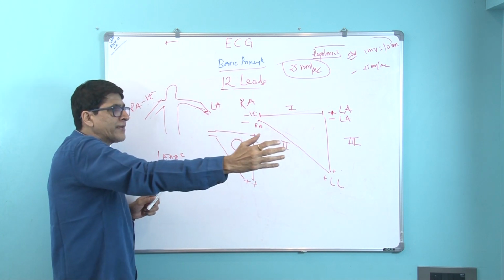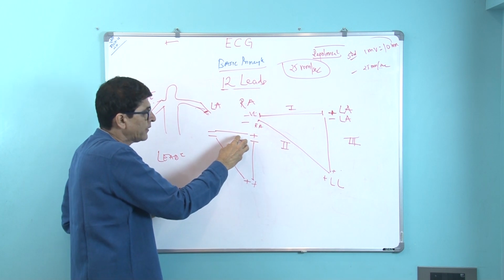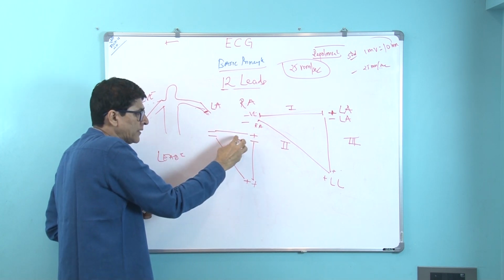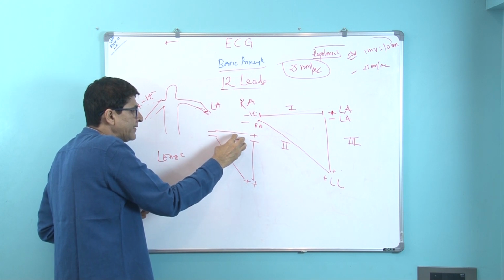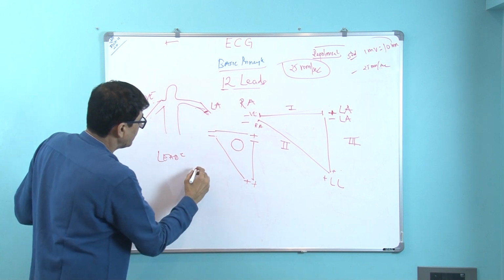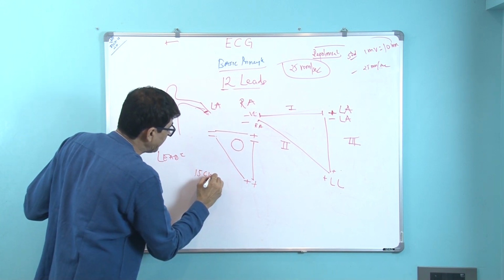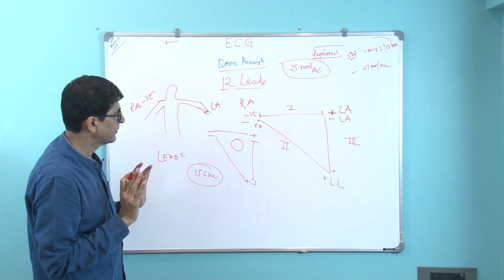Naturally, if you go away from the heart, the electrical field will reduce, and they have found that after 15 centimeters there is hardly any difference noticeable.